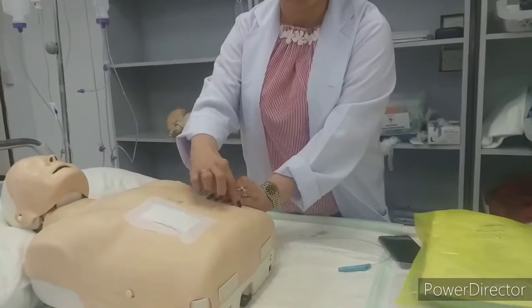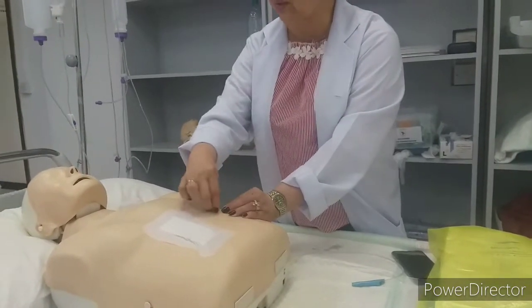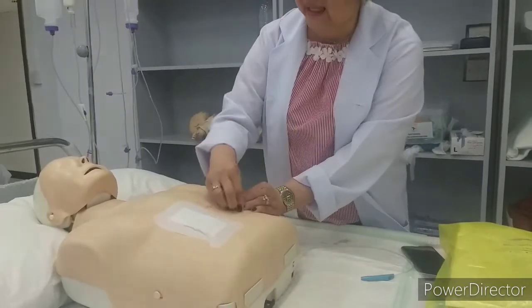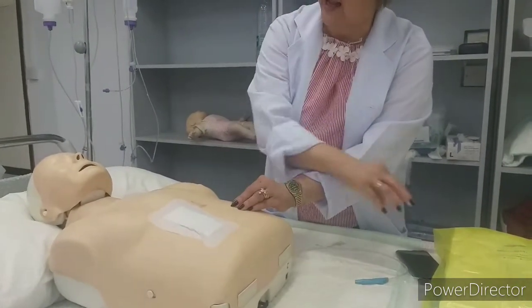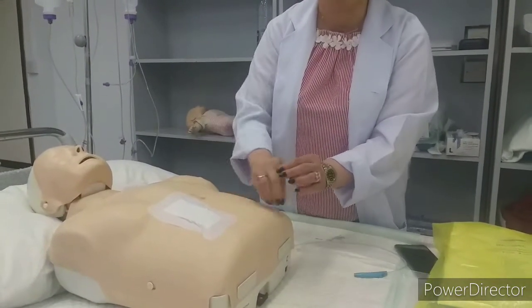Now, there is the surrounding skin. Same. This surrounding, we need to clean with betadine. Betadine, surrounding out. Again, betadine, surrounding out. Again, saline. Out. Saline. Out.